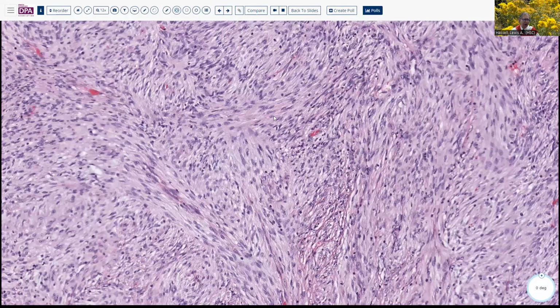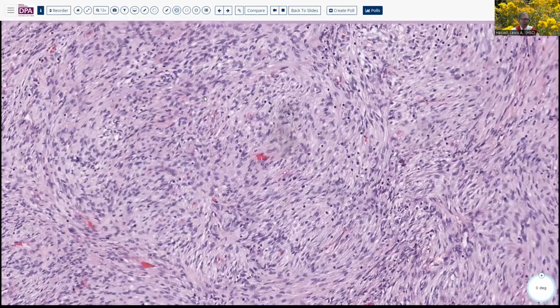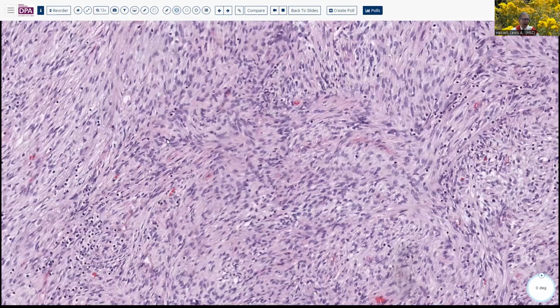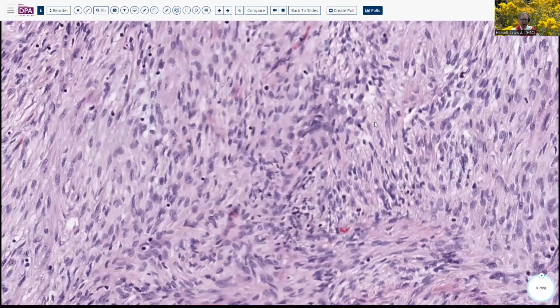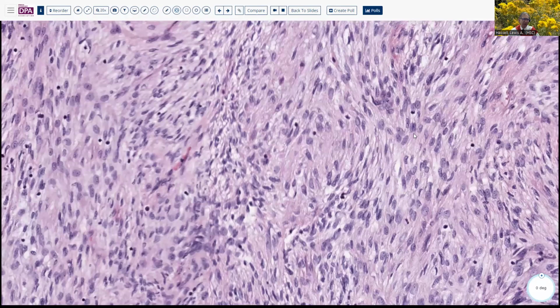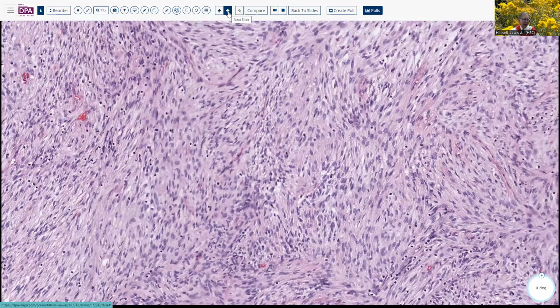And this streaming character, almost sort of tissue culture, is reminiscent of other sort of myofibroblastic lesions like nodular fasciitis and so forth that have this fairly monotonous appearing, not pleomorphic, but very often very active mitotically appearance for these lesions. So as I was saying, these tend to type out as myofibroblastic cells.